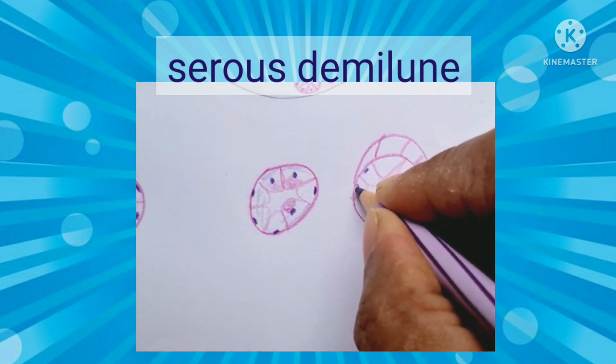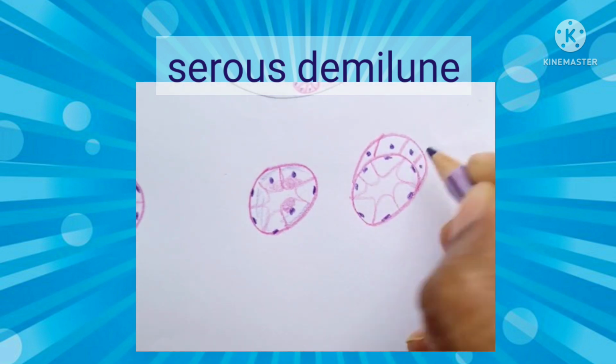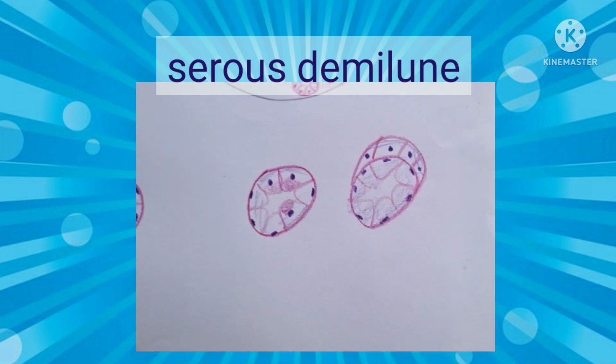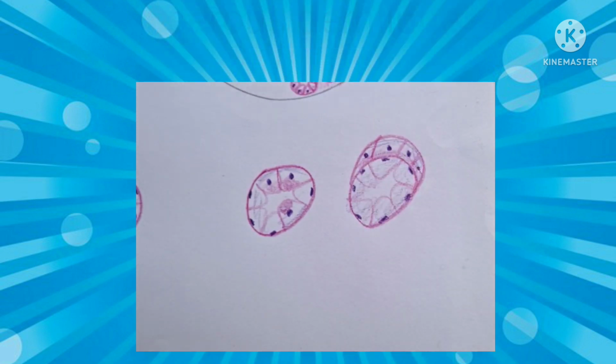But these serous cells will secrete their secretions into the same lumen because they have small cytoplasmic canaliculi, through which the secretions of these serous cells will enter the lumen. So it is a preparation artifact.